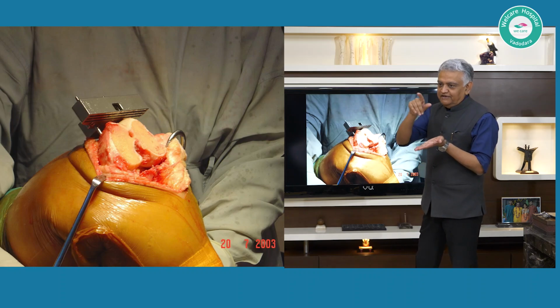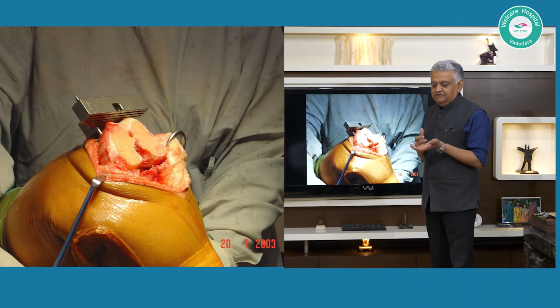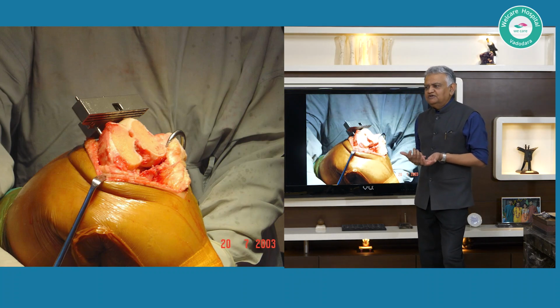So when you are doing your bone cut, whether it be the distal femoral or proximal, you need to know your saw. When you have free moments, when the surgery is over and there is still some battery power left in that saw, pick it up, as I have demonstrated, turn it into a musical instrument and think of yourself as a master musician.